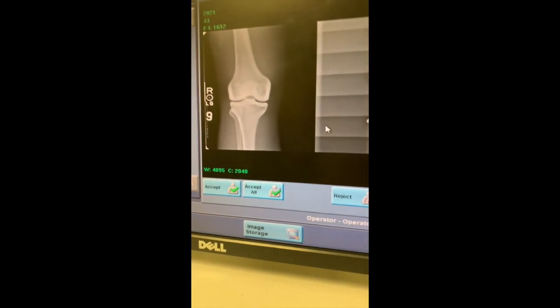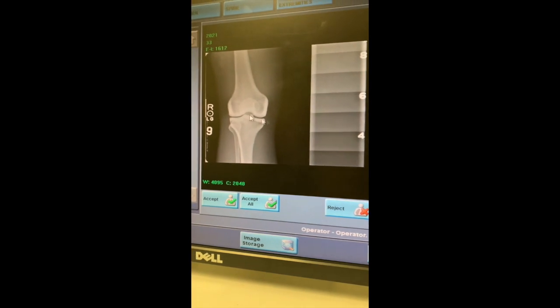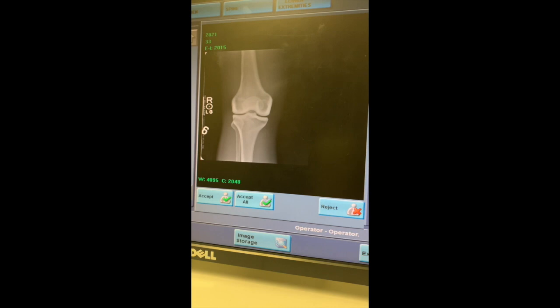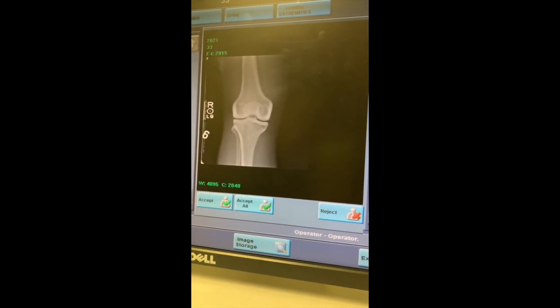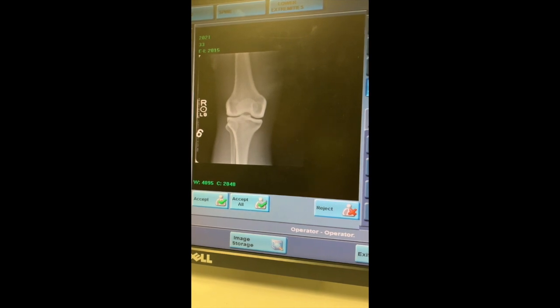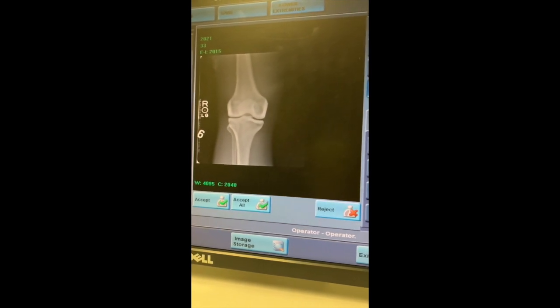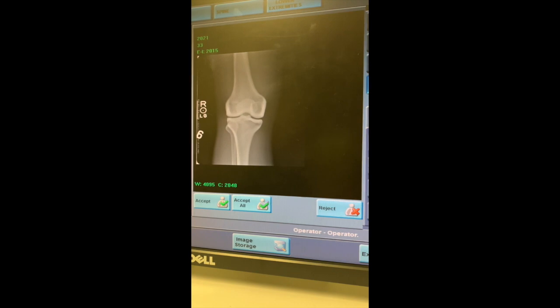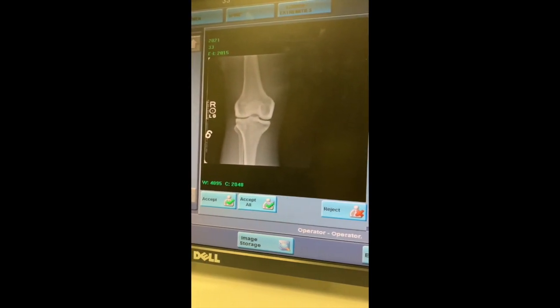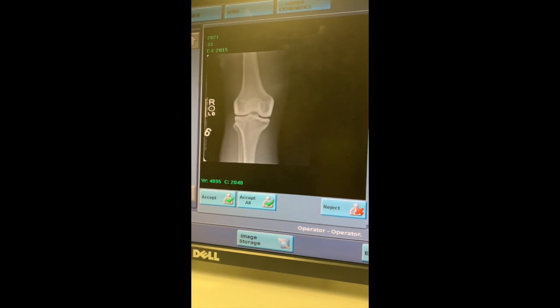Now here's the nice blip of having labs. The third one decided not to include the step wedge. But if you go back and look through these images, and now look at the exposure index number, which is 2015, this one was done at 70 kVp at 5. So we're about in the average range of what a knee would be, because we don't have a grid, remember, so we're doing it all tabletop.